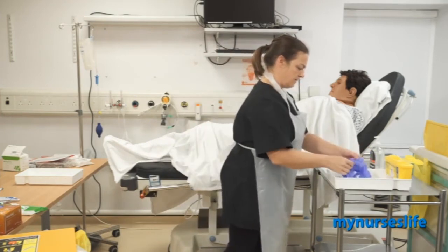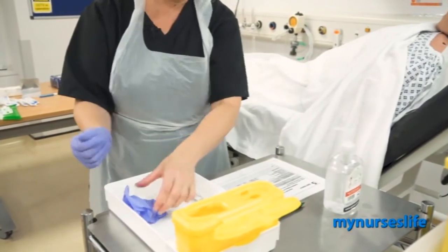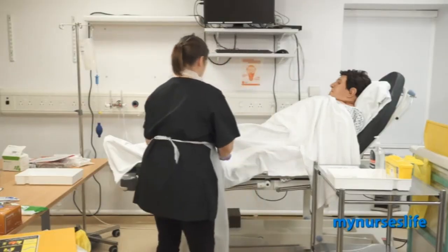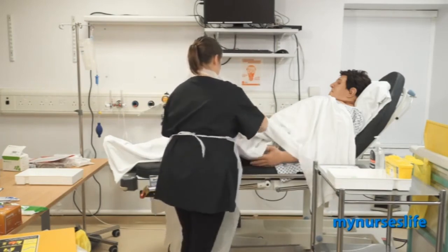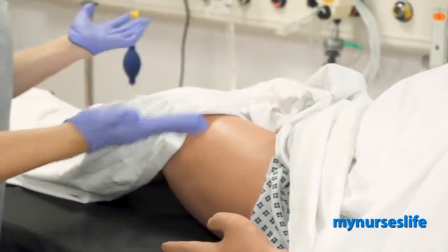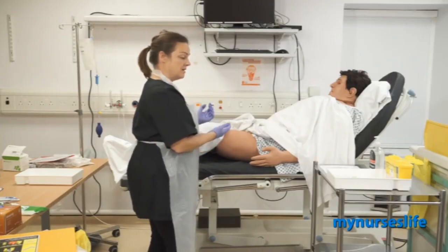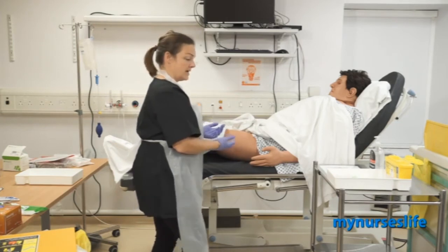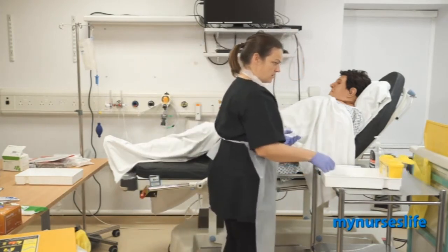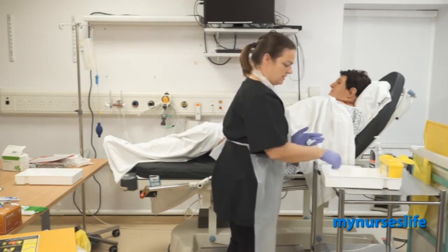Yes, so I'm just going to don the gloves. Just hold my hands. I'm going to take the covers away. And the thigh is intact. The skin is not broken, not inflamed. I'm quite happy to use that area. I don't need to clean Emma because she's clean and she's not immunocompromised in any way.